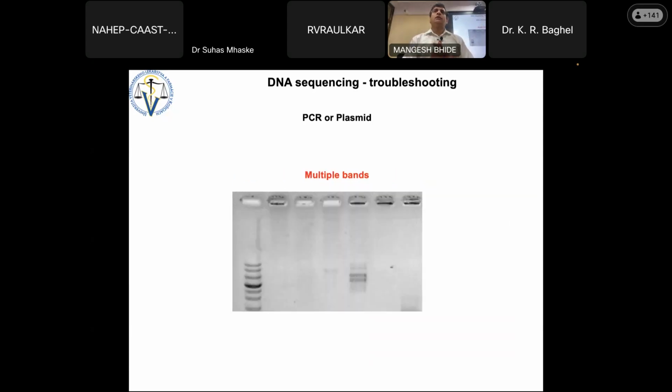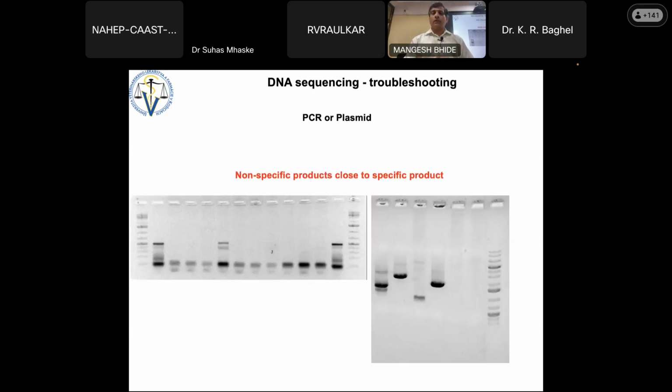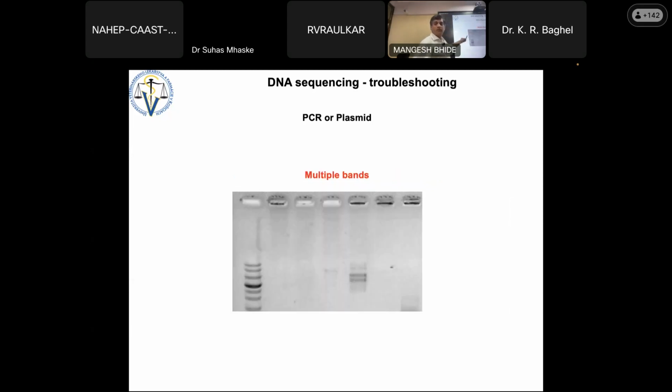Okay, and this is a typical unfortunate result. For example, if you compare this result, at least Vilas was able to say that this could be a specific. Now tell me which is specific here. It is not possible to say.